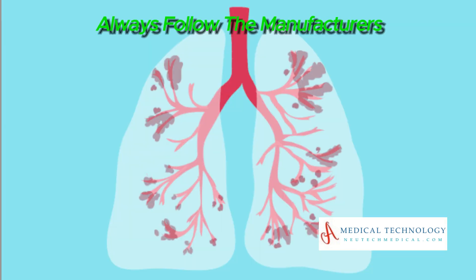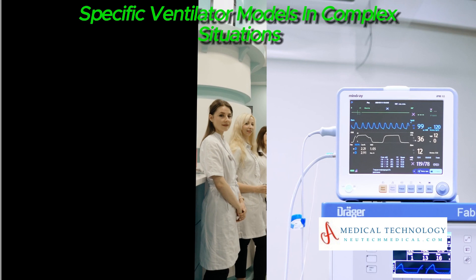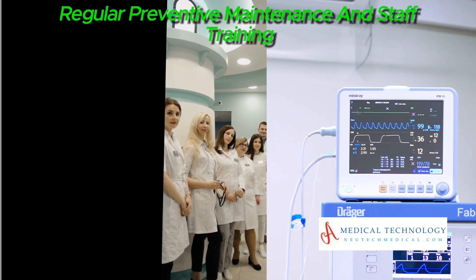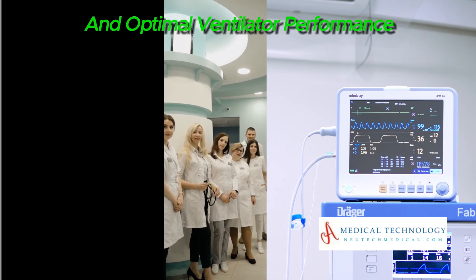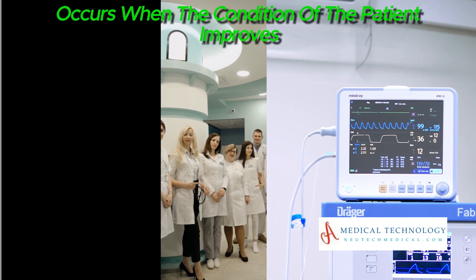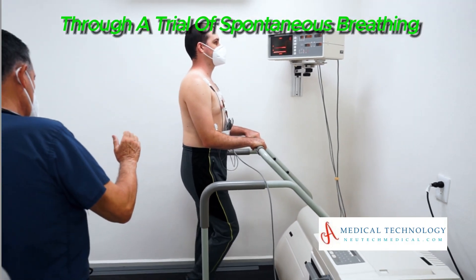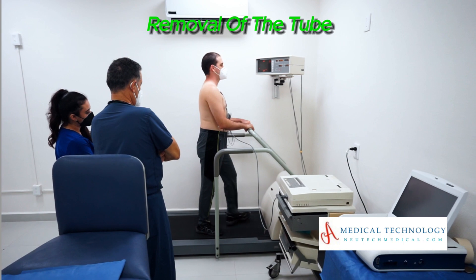Always follow the manufacturer's guidelines and protocols for troubleshooting specific ventilator models. In complex situations, involve respiratory therapists or biomedical engineers for further assistance. Regular preventive maintenance and staff training contribute to effective troubleshooting and optimal ventilator performance. Weaning a patient from a ventilator occurs when the patient's condition improves and a decision is made to remove them from the ventilator through a trial of spontaneous breathing via the endotracheal tube and eventually extubation — removal of the tube.